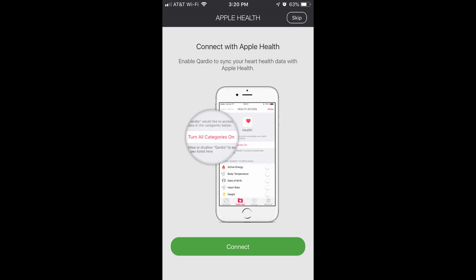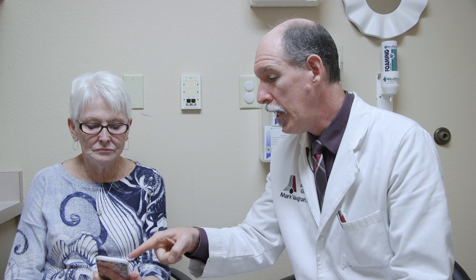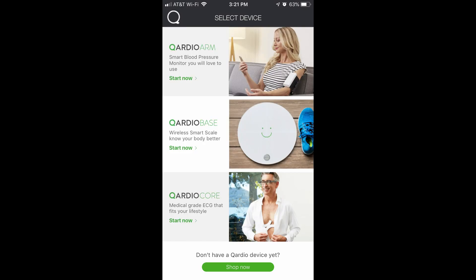The next step is to connect — enable Cardio to sync your heart health data with Apple Health. Some people may want to do this. There's an Apple Health app that comes on the operating system on your phone. You also have to allow it to send you notifications. It gives you a choice of products — we have the Cardio arm, which is the arm blood pressure cuff, so you select that one.